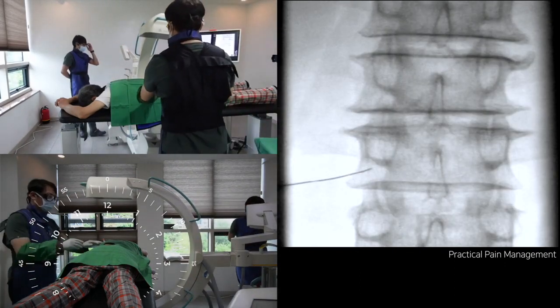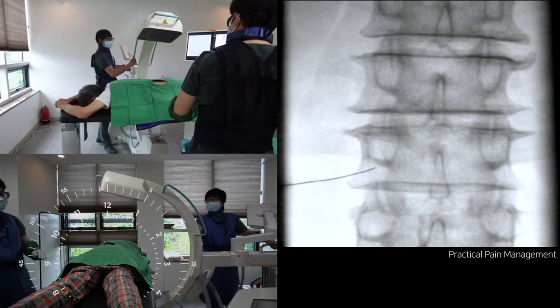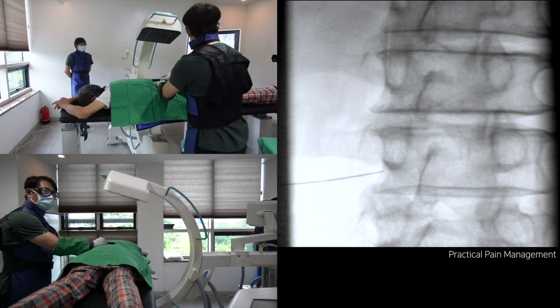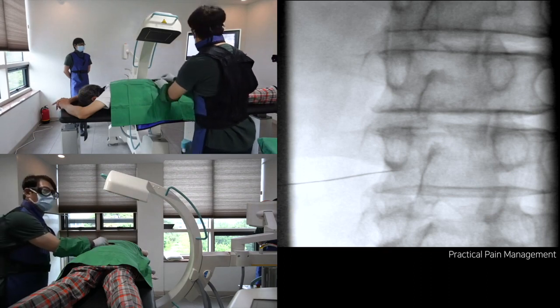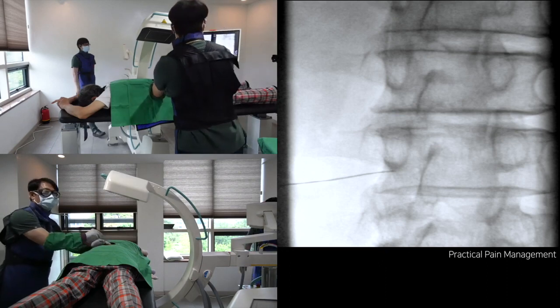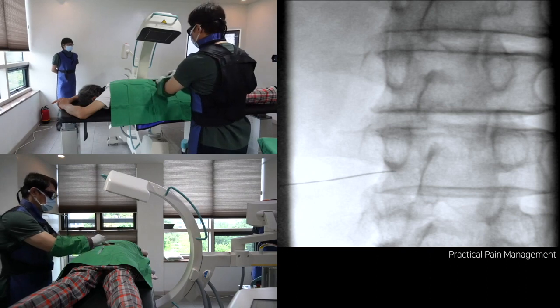Let me show you an AP view. The compass shows 8 degrees of contralateral oblique rotation. The C-arm image shows I need to go further. Please remember the correct ideal position on the contralateral oblique view.